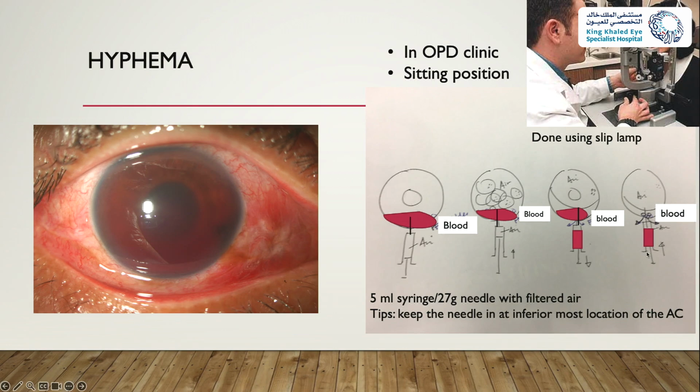At this point, you can do one of two things. You can just leave it like that, or you can take what we did with the air in the anterior chamber using the balanced salt solution, take out the air bubble, and put in balanced salt solution. Now you have done a complete fluid-air and then air-fluid exchange in the office without having to take the patient to the operating room. And it may be useful because if you have a patient that you're concerned about and the hyphema is not clearing, and the question you have is, do I need to take this patient back to the operating room? This procedure can give you some opportunity to do this without taking the patient back to the operating room.